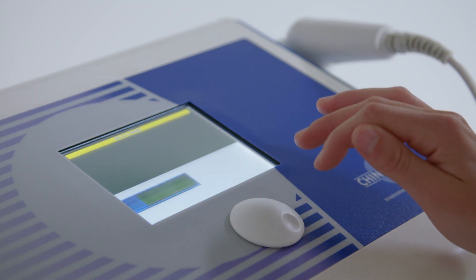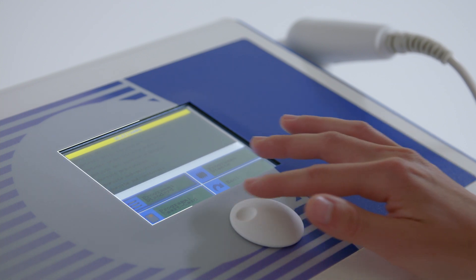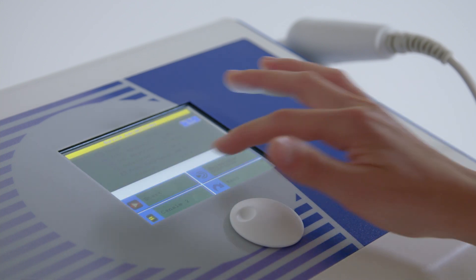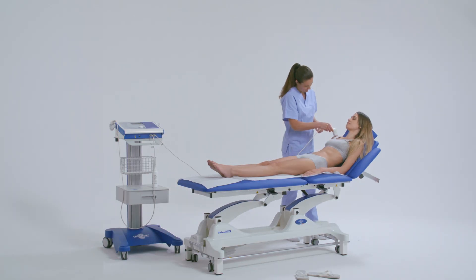From the display interface, select the preset work protocol and start the program for treating the pathology. The suggested protocol can be modified by the therapist according to the patient's needs.